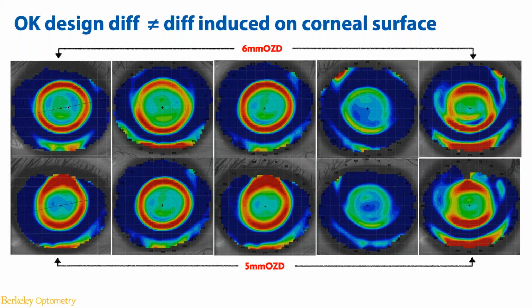Thank you. Yes, it's great to see this from a clinical study perspective, because I think if we were to see these results in clinic, we would somewhat panic and think we need to troubleshoot this lens. But every cornea reacts differently to orthokeratology lenses, and understanding that corneal anatomy and morphology is also a very large area of interest in the research field. Exactly.